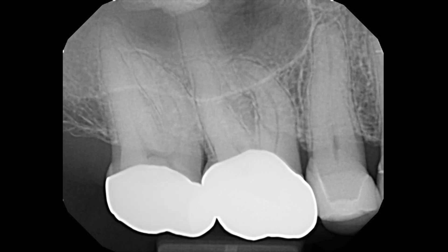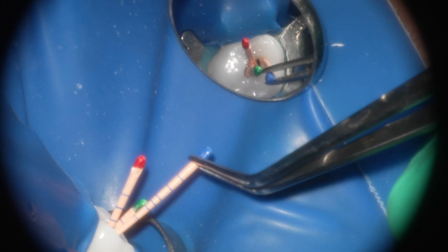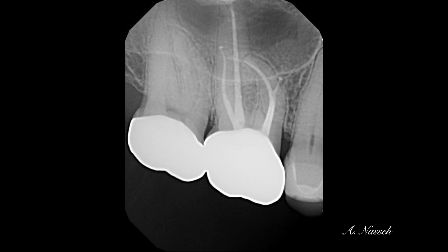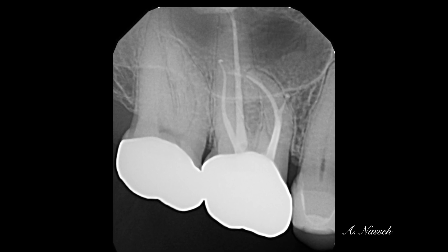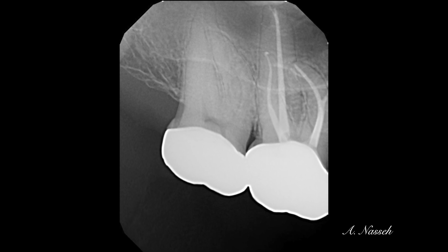Going back to the original image: this tooth was filled with about four cones — a size 35 in the palatal, a 25 in the distobuccal, and a 30 in the mesiobuccal along with a 25 in the distal. With hydraulic condensation it looks like it was filled with warm vertical condensation, showing that hydraulic condensation achieves a very good amount of hydraulic pressure. It's much better to have a bioceramic cement in these types of irregularities than something that can wash out, resorb, and shrink over time.